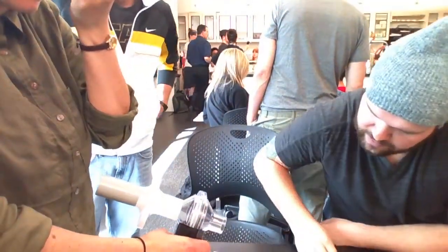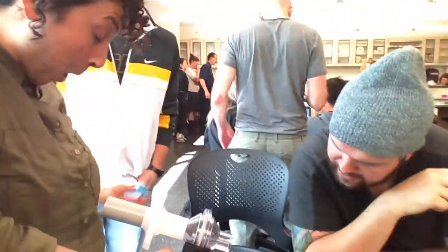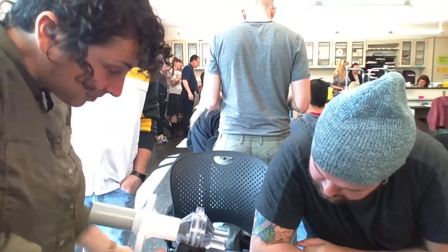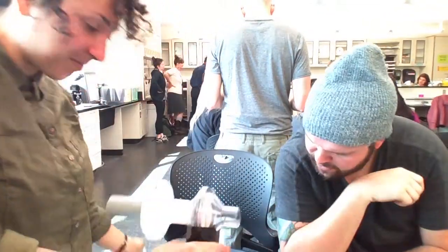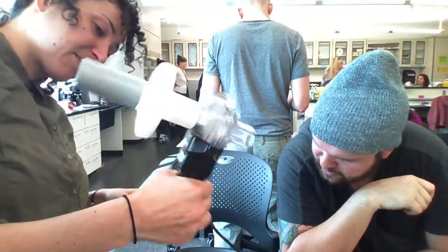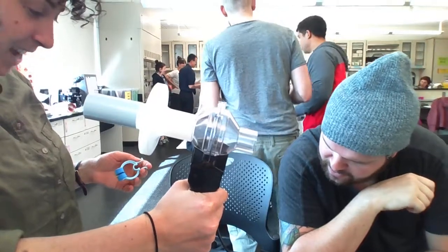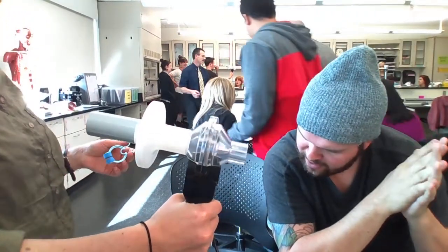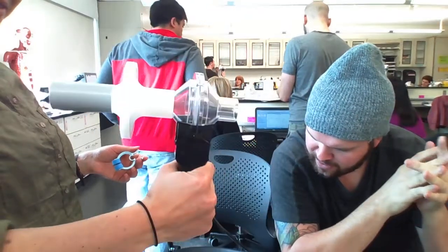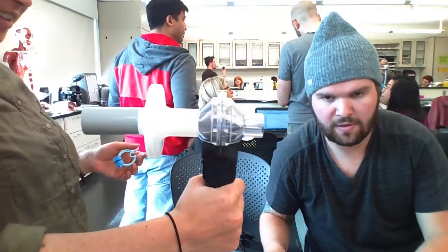Will you give me the instructions? You can read them loudly. Nose clip. Okay. Attach the larger diameter side of a white bacterial filter to the spirometer. Okay, we got all that. Hold the spirometer in your right hand and brace your arms against a solid surface, such as a table. The spirometer must be held straight up and down and not moved. Like this? Yeah, don't move it. So this is the spirometer.